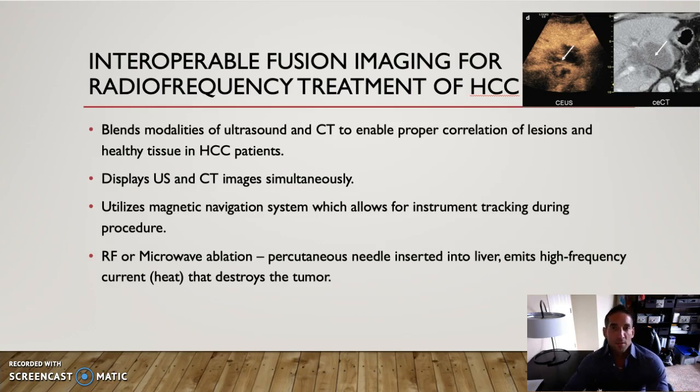After the 2 images match well, or they've mapped out the patient's anatomy, the operator increases the visualization of the tumor, which allows for greater accuracy and precision. The ultrasound allows for guided tracking too. So when the physician or surgeon wants to go in and ablate these tumors within the liver, the ultrasound gives them a real-time image of where they're located within the patient's anatomy.